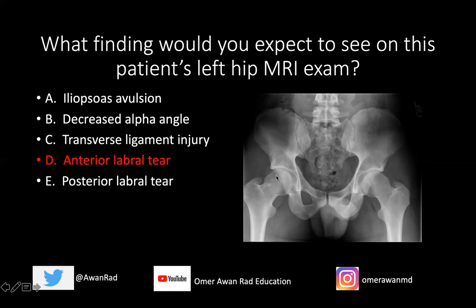We know that these patients get anterior superior labral tears, and they have a predisposition to early osteoarthritis. We can already see in this 20-something-year-old some subchondral sclerosis and a developing subchondral cyst along the superior lateral acetabulum. No 20 or 25 year old should have stigmata of osteoarthritis unless they have a predisposing condition like FAI or trauma leading to post-traumatic osteoarthritis.